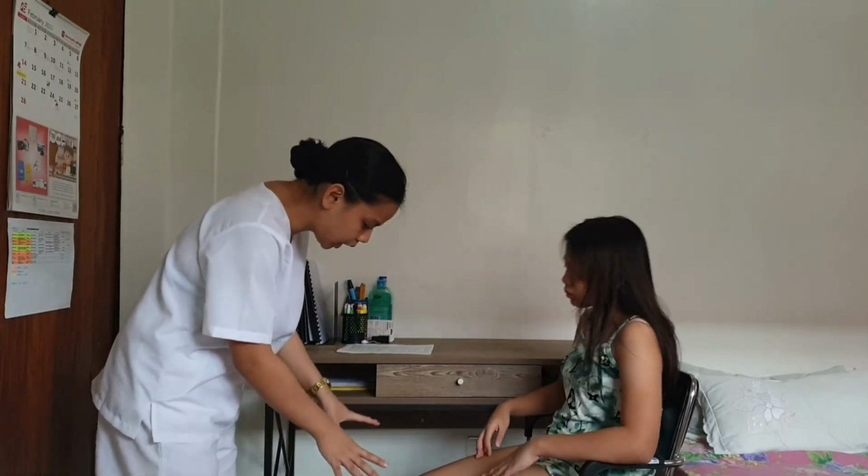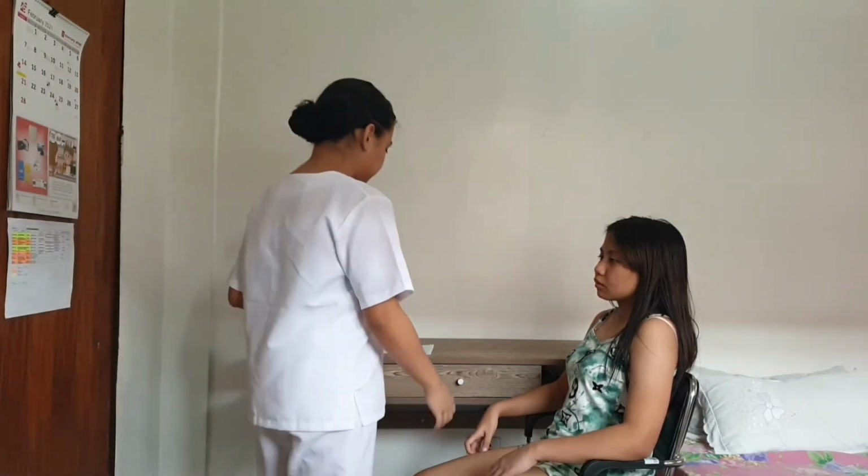But now I want your feet to be flat on the floor because crossing your legs at the knee will result in elevated systolic and diastolic pressure. And I want your arms to be at your heart level because if it is above your heart level, it will decrease your blood pressure, and if it is below your heart level, it will increase the blood pressure. Okay?